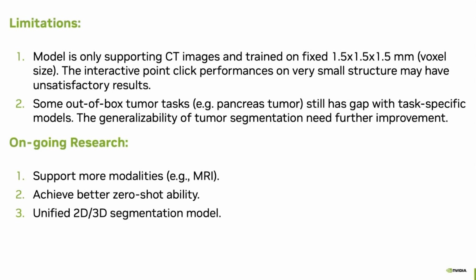And we're developing the next version of VISTA to support more modalities. We already curated a large collection of MRI, and we will enable support for MRI in our next version. Also, we're finding more effective ways to improve the zero-shot ability. And the ongoing research also includes unifying the 2D and 3D segmentation.